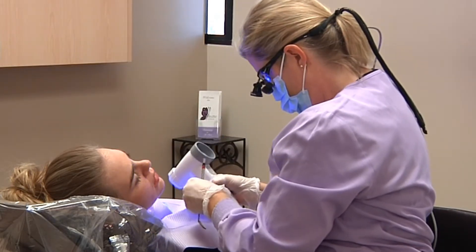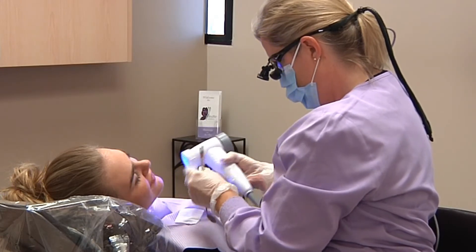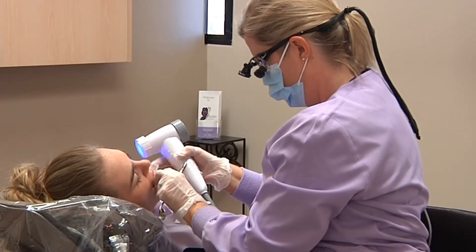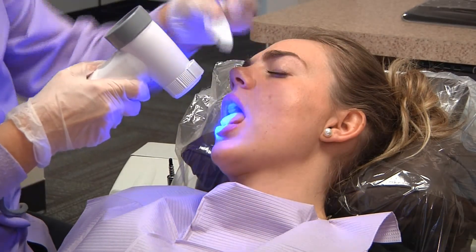I'm going to have you stick your tongue out at me. I'm going to grab it with the gauze just for a moment — go ahead and stick your tongue out. This is letting me see the floor of your mouth more clearly.